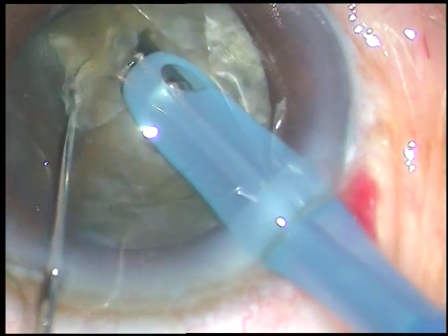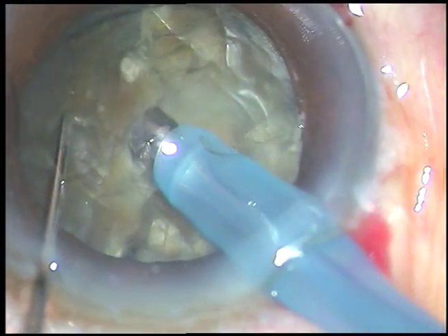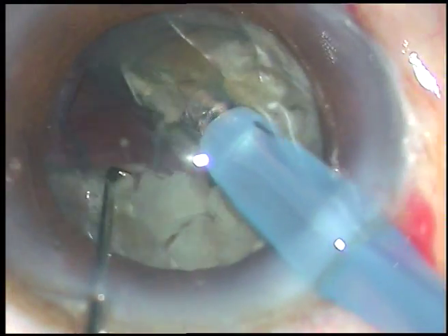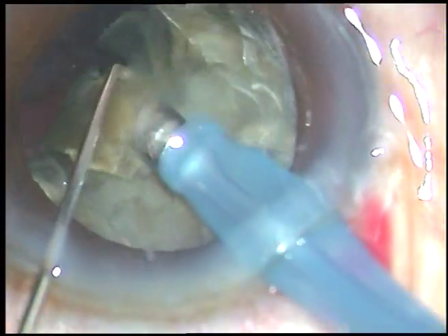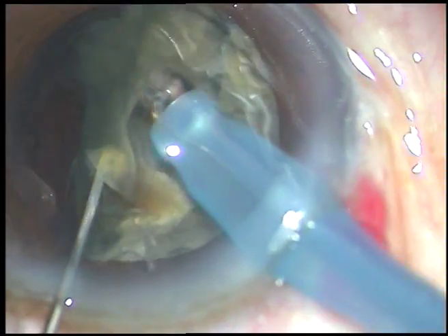This is how I hold and chop. Chopping with this machine is a joy because holding is very firm. No financial interest, but I love this machine very much — the Oertli Cataris 3 phaco machine.